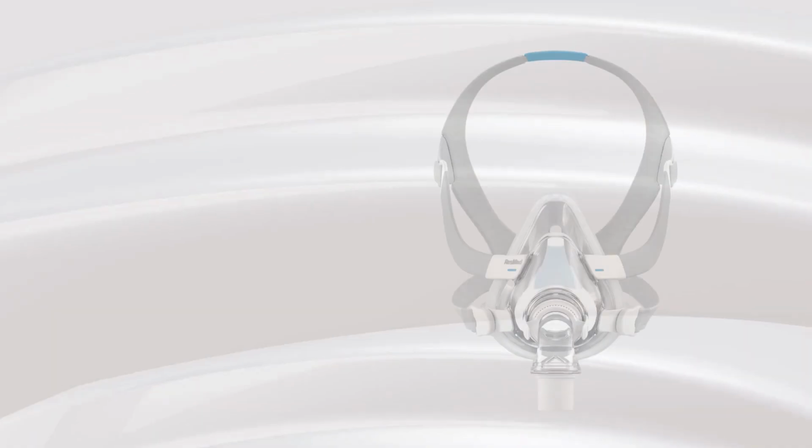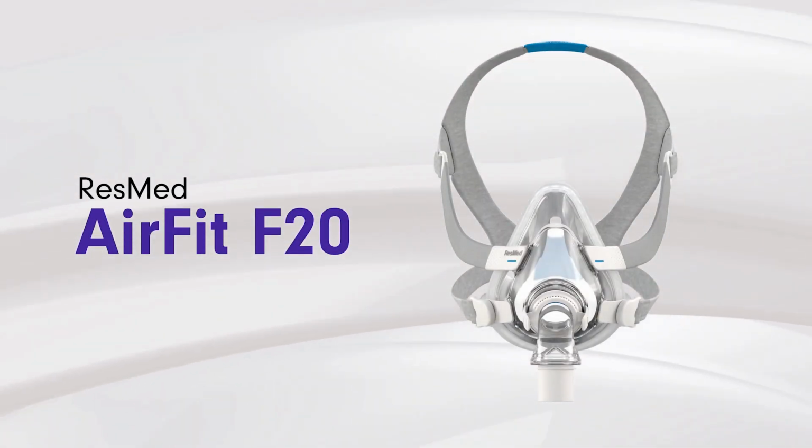So one of the things that you can do is not tighten your mask too much, obviously. And if you're using a full face mask and a gel mask, there's the AirFit F20 from ResMed. It's a gel mask, but it also has the option of changing that cushion to the AirTouch cushion, which is like a memory foam, okay? So it's soft, it's not gel, because with gel you can sweat, and then that sweat can open the skin, right? With the foam, some patients find it a little more comfortable. They also get a better seal on the mask, because the foam kind of fills in all those little spaces or cavities that are open around here when you lie back, okay? So the AirTouch F20 is an option to do that.